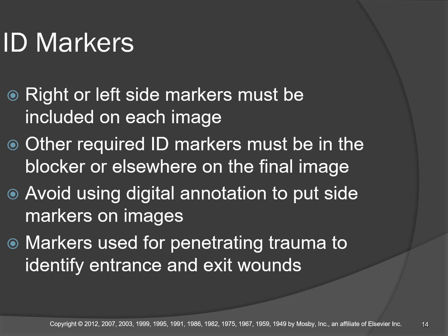There's also additional markers. They might call them bullets or arrows. They might have a roll of those in the control area. And there's also post-procedure annotation with some of the softwares where you can actually mark the wound.